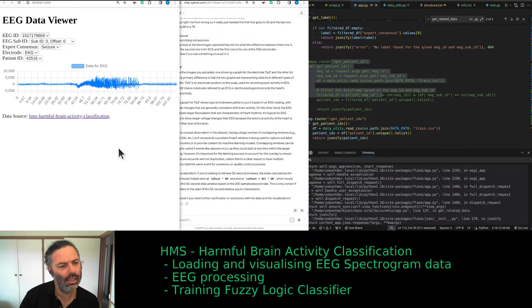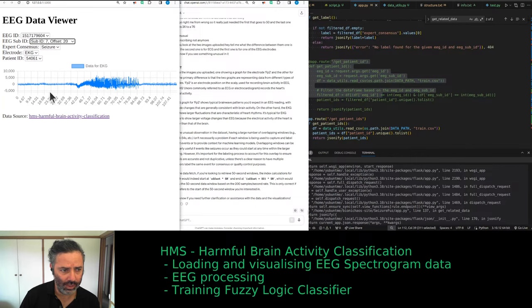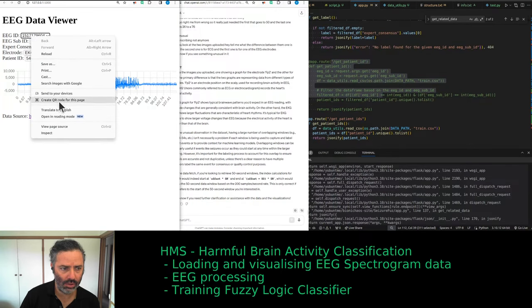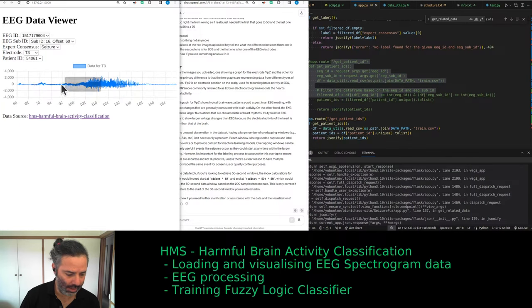Yeah, so that's the thing about it, the overlap is only okay, or so much overlap is only okay, if the labels are different, but I don't think there was an intention to label them differently. Like, if all of these things are labeled as seizures, that's wrong, because this should have been, say, no seizure, seizure onset, end of seizure, and acquired after the seizure. Actually seem to be legit in this case.